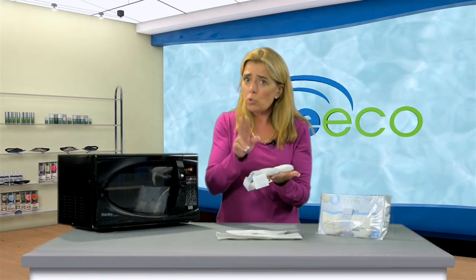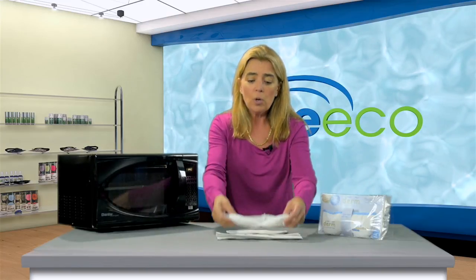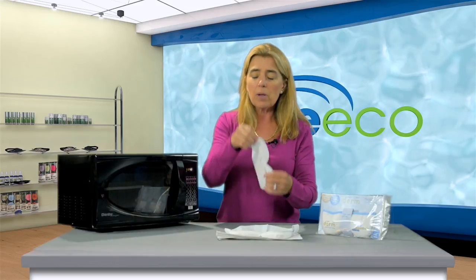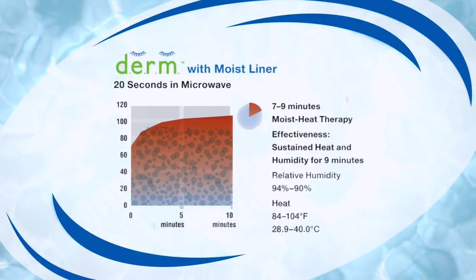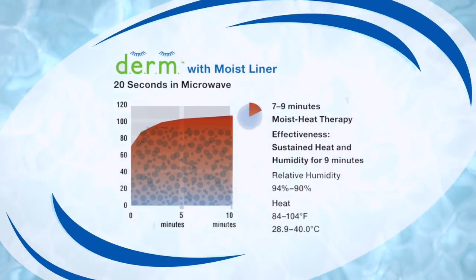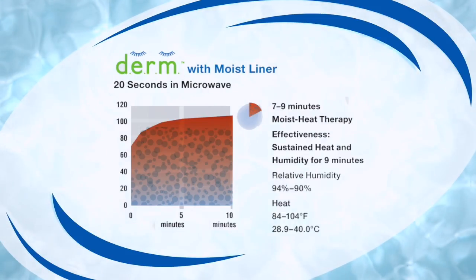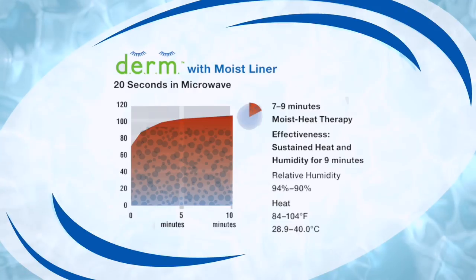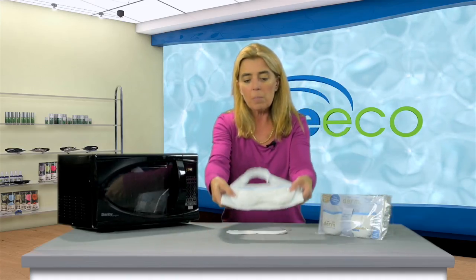With this product, you have two choices. As described, you can put it in for 20 seconds. Or to extend the moist heat, which a lot of people like to do, we provide complimentary liner samples for you to try. You can simply put this liner into some water before heating it in the microwave, which extends the duration of the compress by creating a moisture barrier between the heat source and your lid. Then gently lay it over the top of the mask.